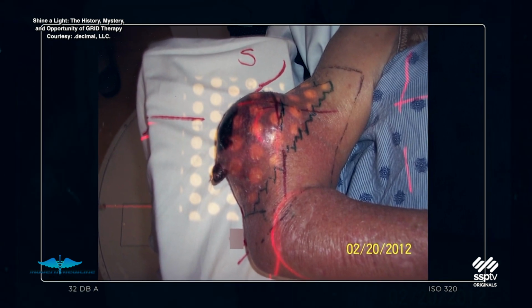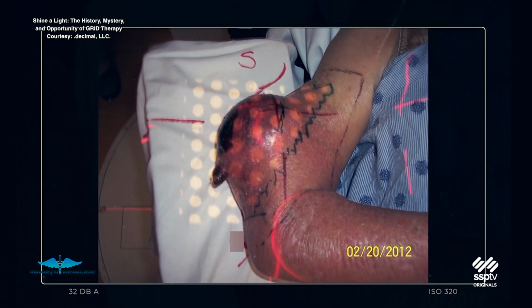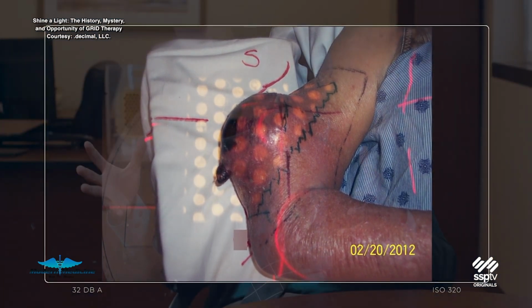The conventional treatment is to give preoperative radiation, which is about 50 gray. And then ideally, if you have some sort of response, they go for surgery. So she started off with some conventional radiation, but the problem is this sarcoma, for whatever reason, was growing as we were doing the treatment. From the time of simulation to the time of treatment, it was bigger than the field they had created for it, and there was literally a tongue of tumor extending out. So the question was what to do. And so I said, let's try to do this grid treatment.